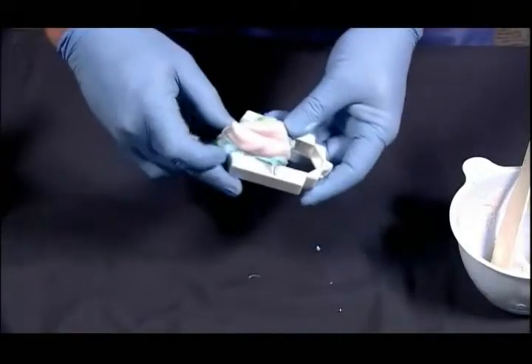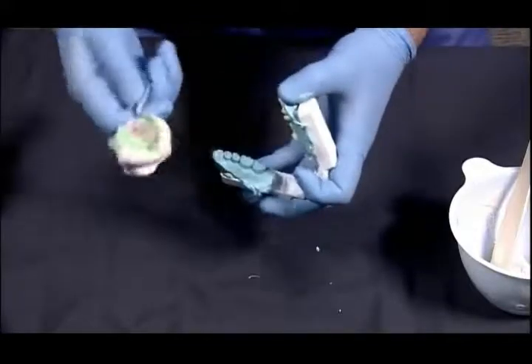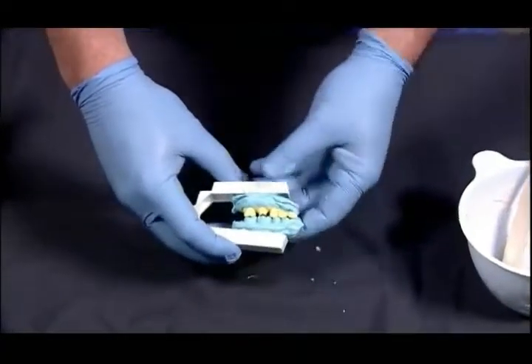All right, let's see. There we are. We're going to disarticulate that. And there we have our final die. And we're ready to go to try in our provisional.